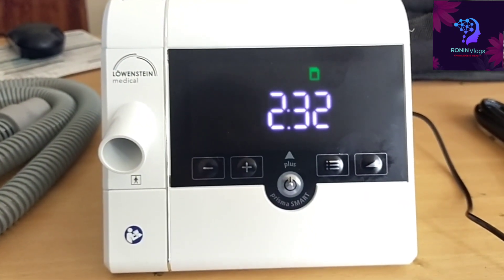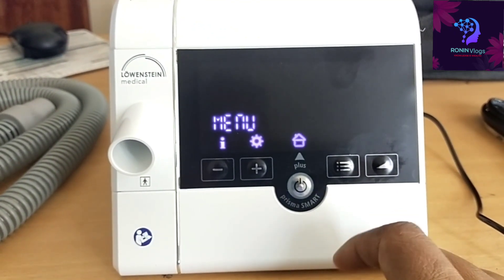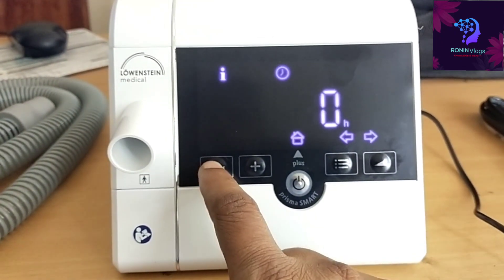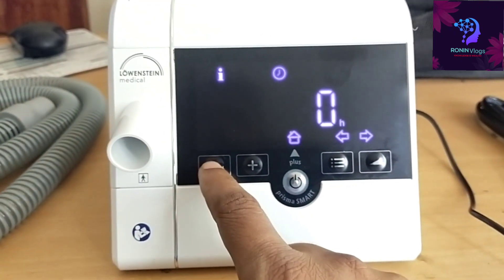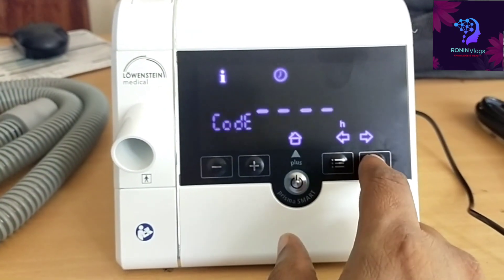This is the main menu. When we press the info button, we can see the data — how many hours the machine has been used. Because this is a new machine it shows zero hours; if we use it for four hours, it will automatically show that.